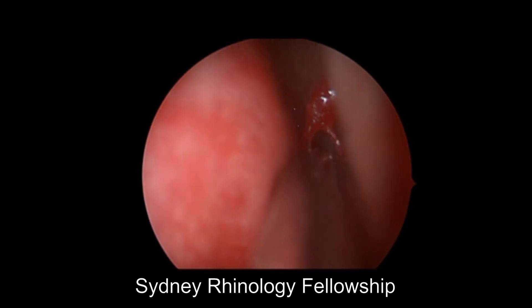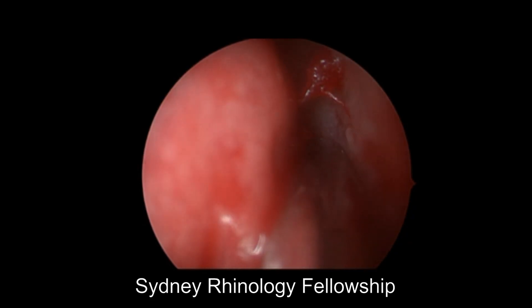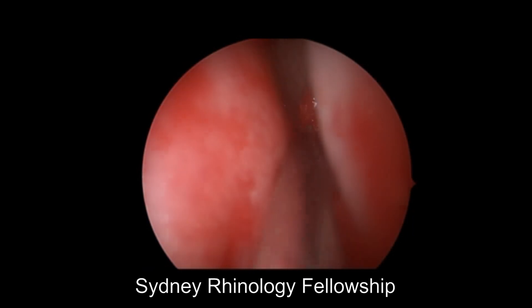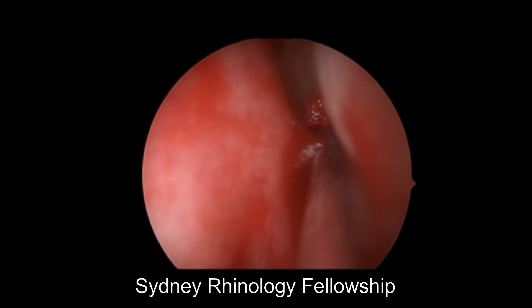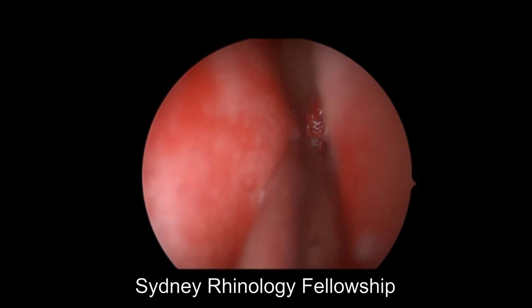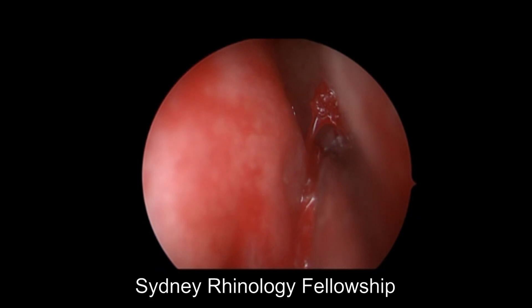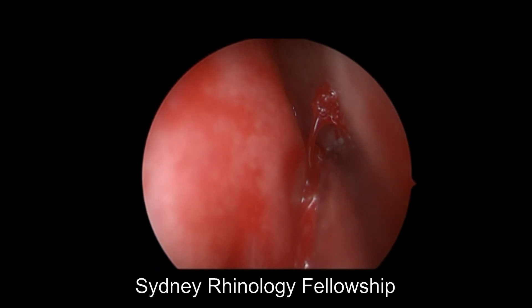If you are looking for evaluation of the nose for bleeding sites, these are the two most common areas: Little's area in the septum, and then the S-point in the anterethmoidal artery.